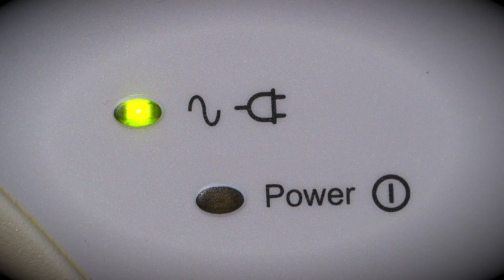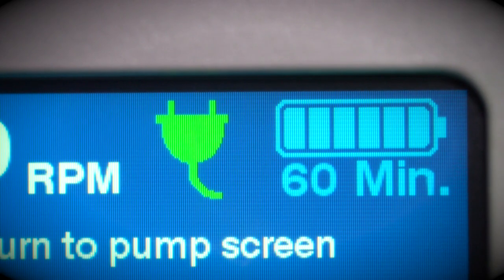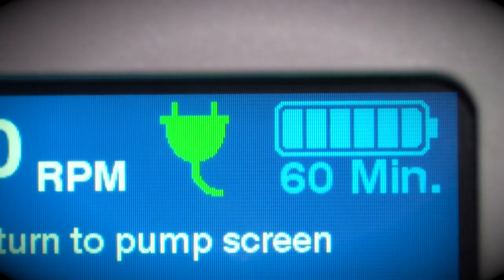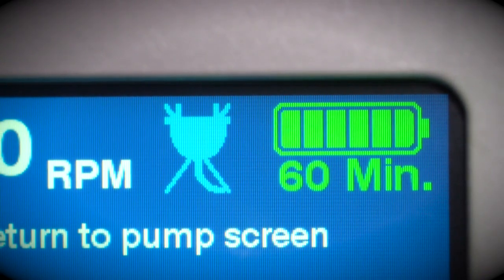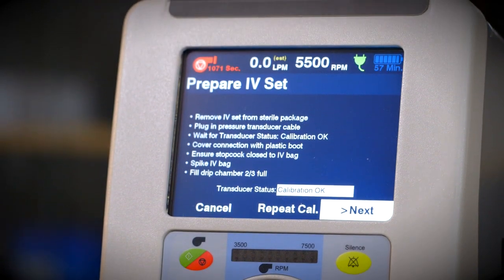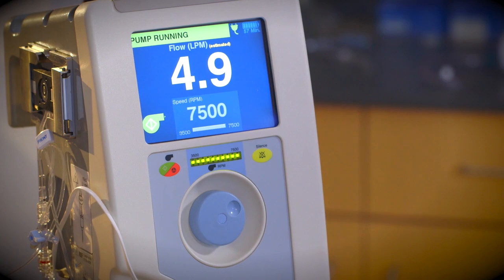The controller should be plugged into AC power at all times to ensure that the batteries remain fully charged. Internal batteries may provide 60 minutes of continuous operation during patient transport to a critical care unit. Remaining battery life may be viewed on the controller touch screen. The controller's display serves as the user interface to monitor and display system setup and operating information.